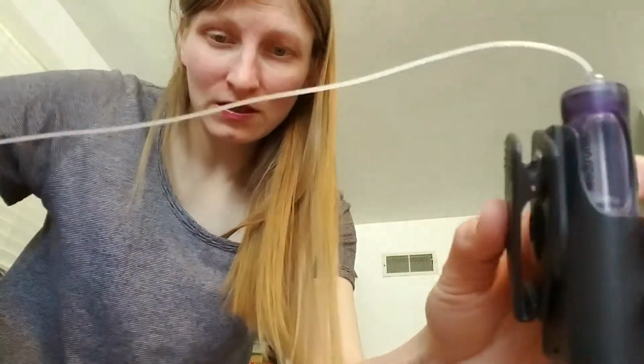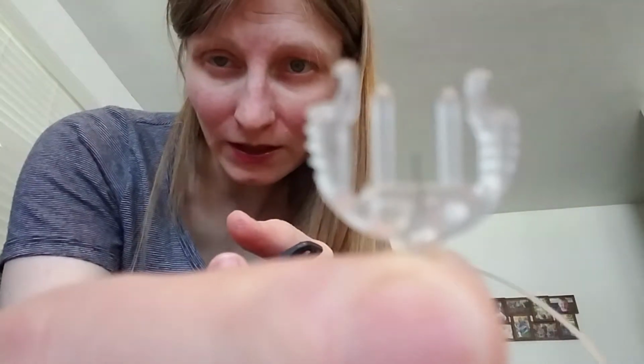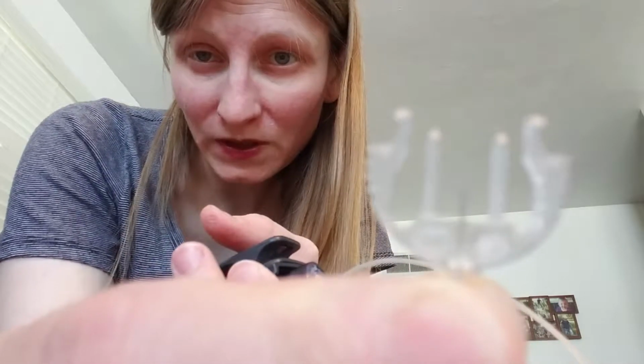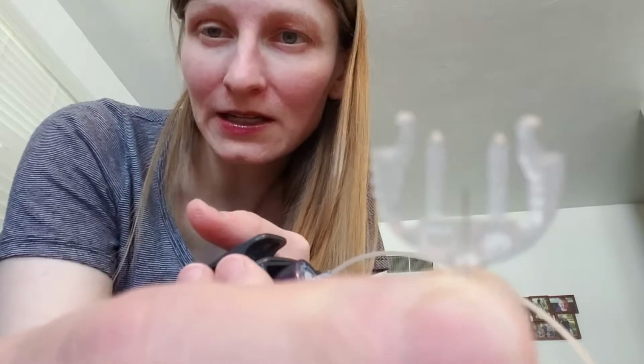There we go. Okay, now like I said, this has air in it, so there's a little protective cap on the end, take that off. And then there's a needle on that. You see that? That doesn't go in my skin, that goes into the cannula, the infusion site that is in my skin.